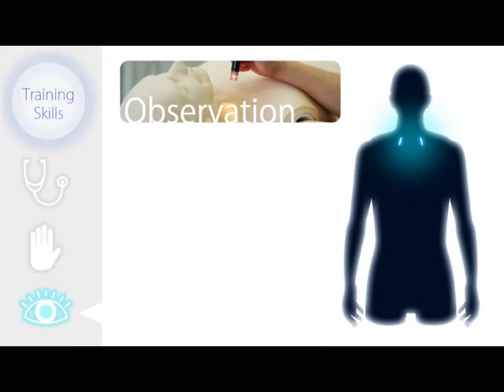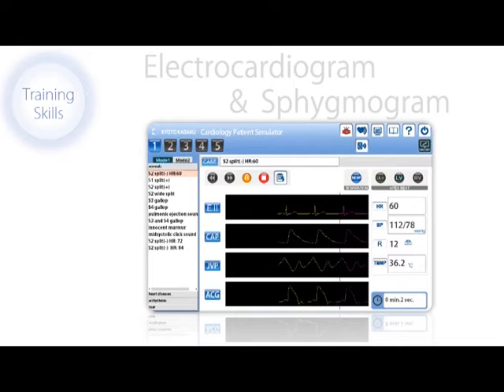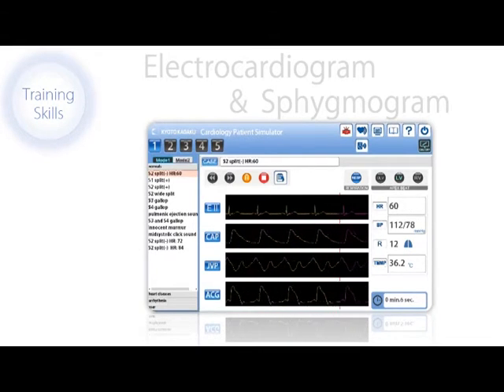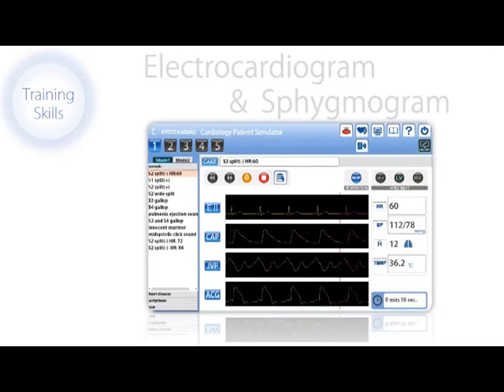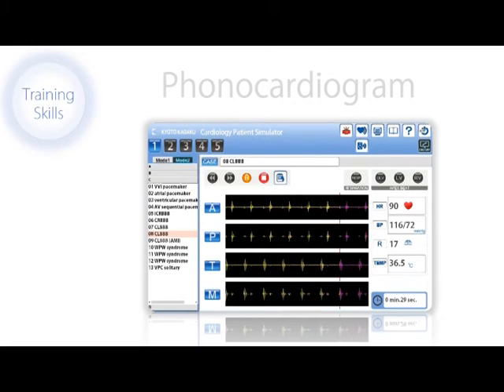A replication of the jugular venous wave movements also creates a realistic training session. The electrocardiogram and sphygmogram are displayed on the provided tablet and main screen with easy-to-read visuals and operation buttons. The display can also be changed to the patient's phonocardiogram to visually track the heartbeat condition of each patient case.